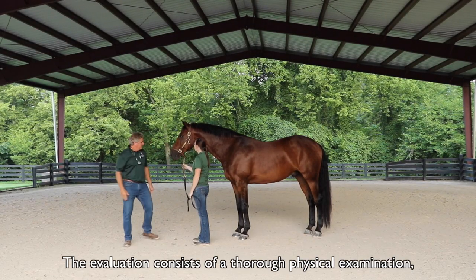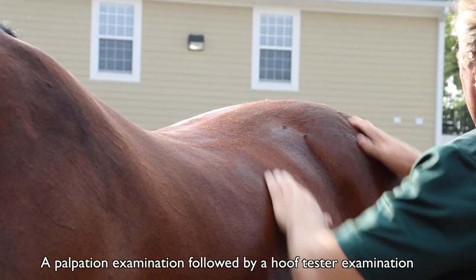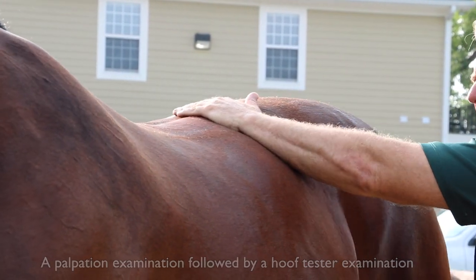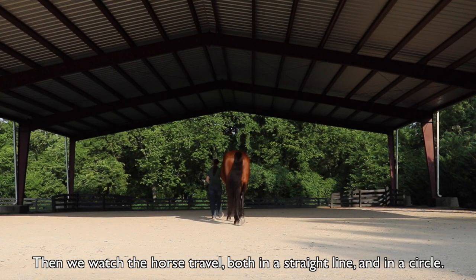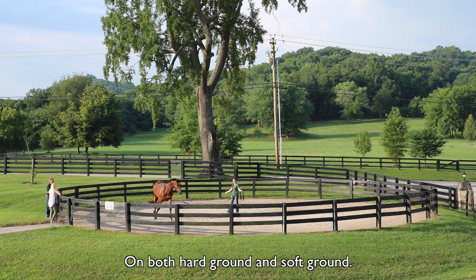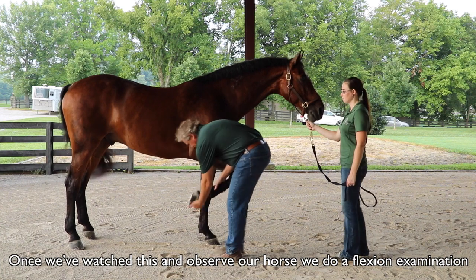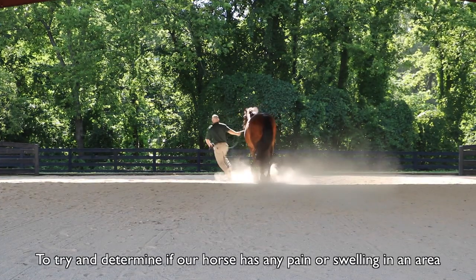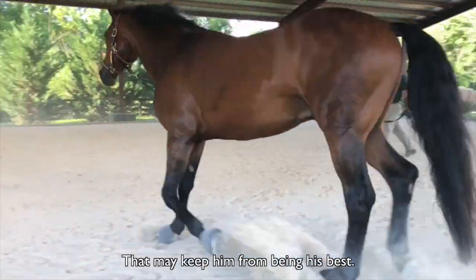The evaluation consists of a thorough physical examination, a palpation examination, followed by a hoof tester examination. Then we watch the horse travel both in a straight line and in a circle on both hard ground and soft ground. Once we observe our horse, we do a flexion examination to try to determine if our horse has any pain or swelling in an area that may keep him from being his best.